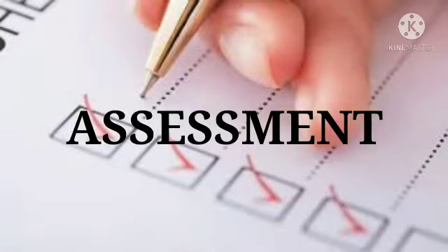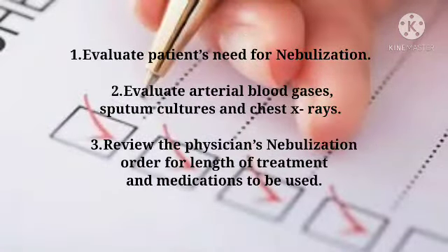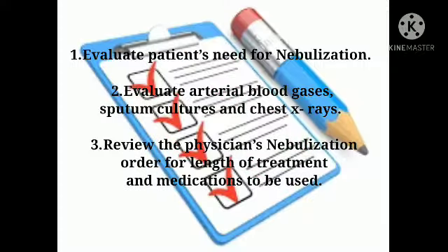Assessment. Evaluate patient needs for nebulization. Evaluate arterial blood gases, sputum cultures, and chest x-rays. Review the physician's nebulization order for length of treatment and medication to be used.